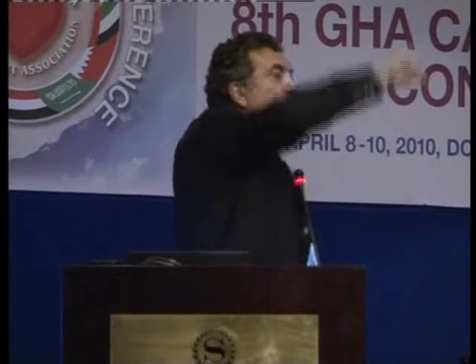If in the next 2-3 minutes you have ST depression or ST elevation, chest pain, etc., you consider this side branch as a significant side branch, and we will certainly have to move to treat it.